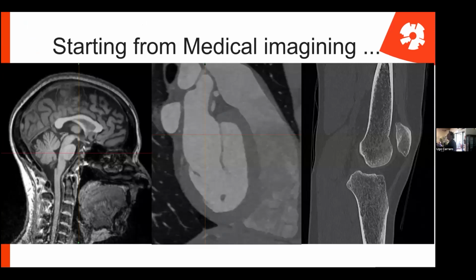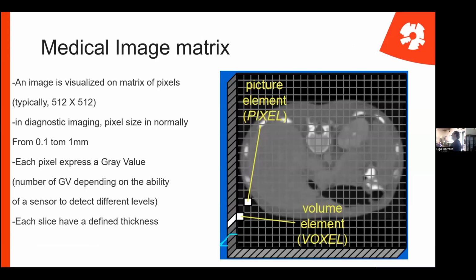imaging. So I've been a PhD student in Vienna with the group of Winfried Meyer, and our contribution, or the idea, was to label the growth of muscles with morphological analysis, and not only morphological, but also densitometric.